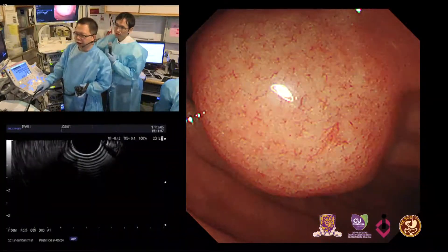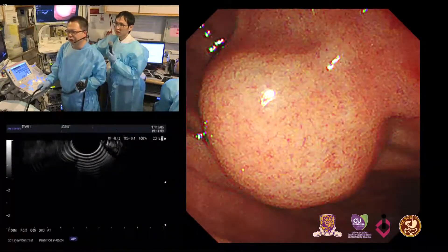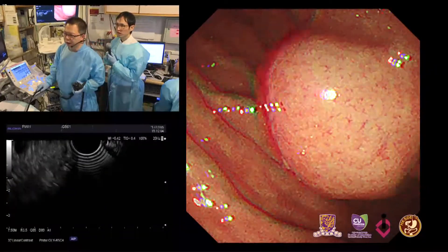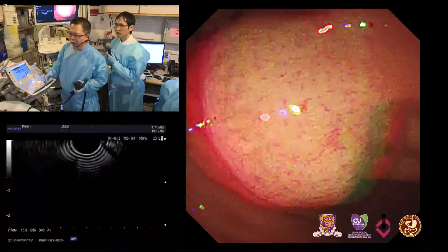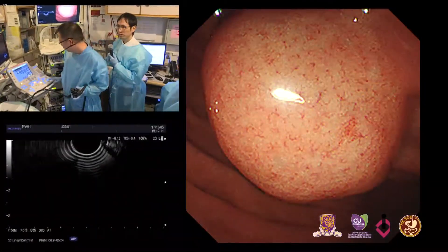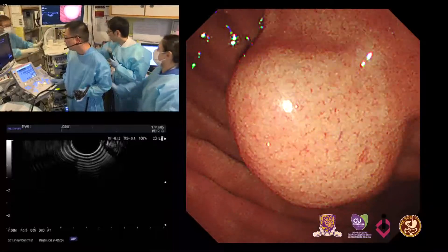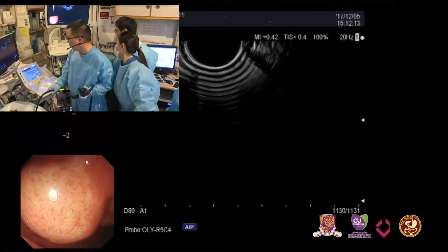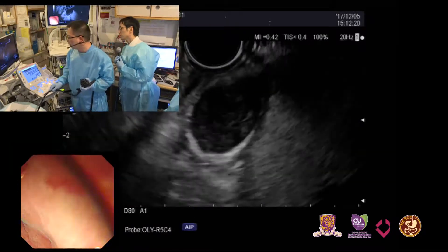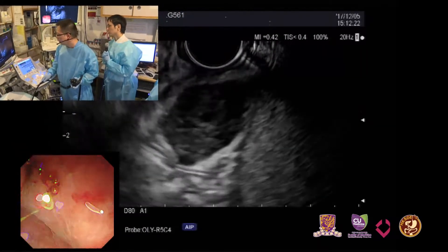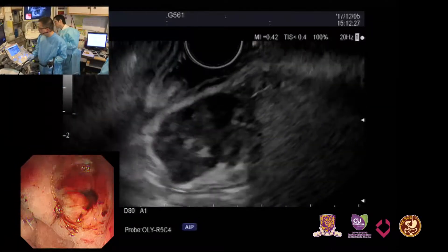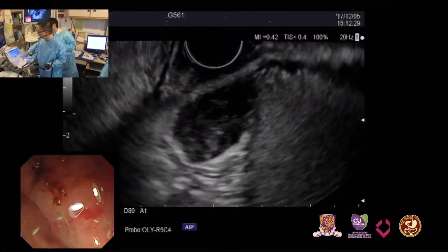EUS is very useful to differentiate the diagnosis of submucosal tumours because it can identify the originating layer of the lesion. We can see the EUS image now. This is a hypoechoic region, and we can see the originating layer.